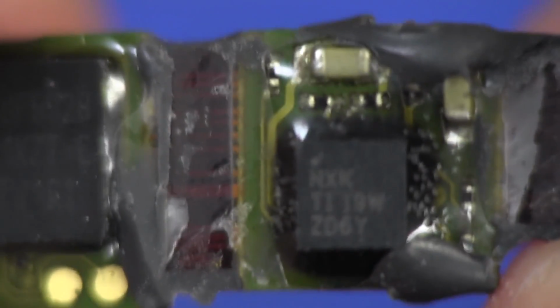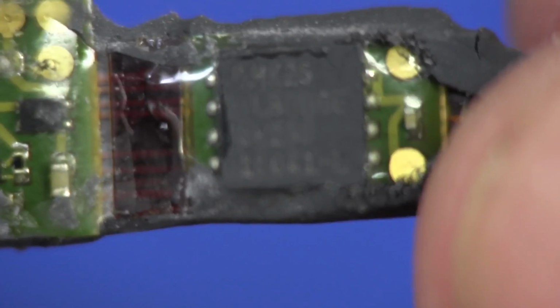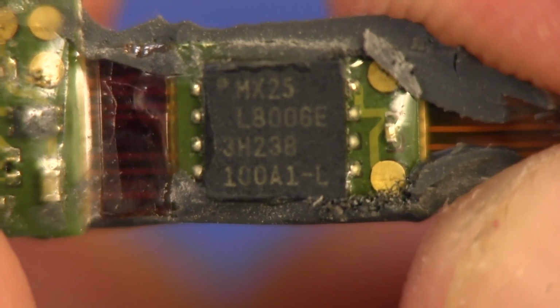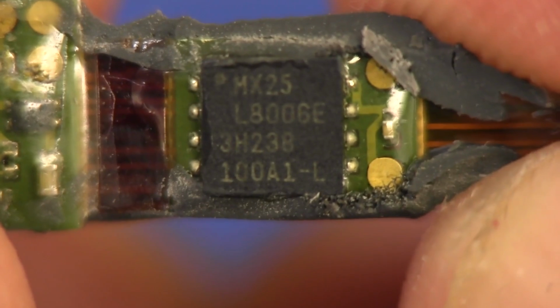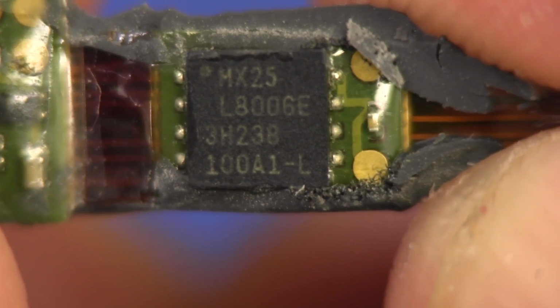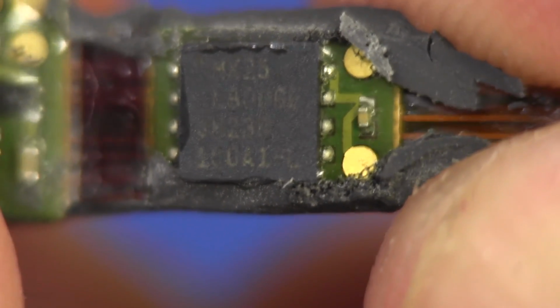It's all very tightly integrated, because assembling these things would cost you an absolute fortune, and you wouldn't do it unless you absolutely have to. And that right there, the MX25L8006E, that's an 8 megabit serial flash from Macronix, and you can see it's a leadless chip carrier there.